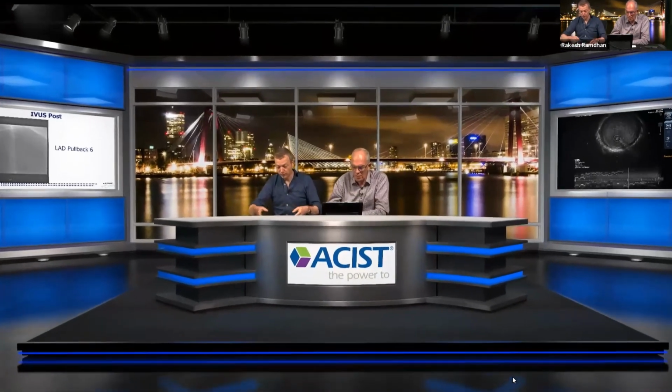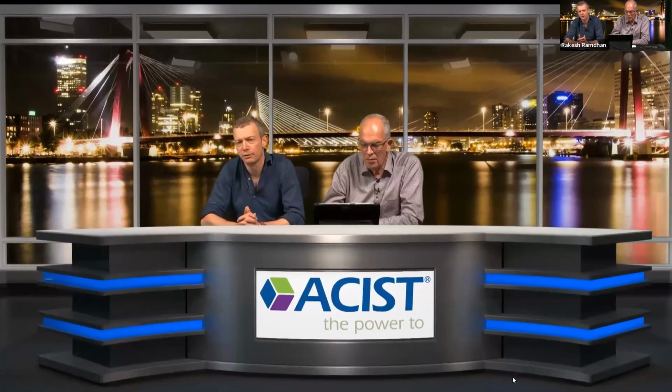What we've tried to do in this webinar is to make you familiar with the different types of plaque you can encounter in patients presenting with ACS, and to get a little bit familiar with the different types of thrombus. Stent sizing and thrombus adjudication can help you, but can also put you in an uncertain position when you think about sizing. Use your common sense and use your imaging in a structured way. And that is perhaps the most important message that we can give to you.